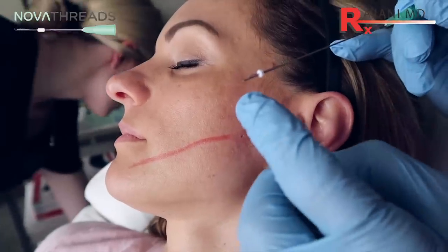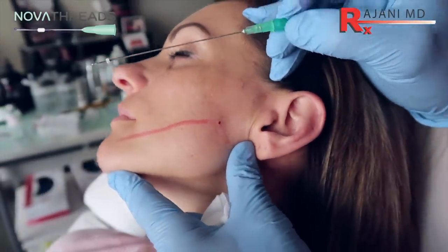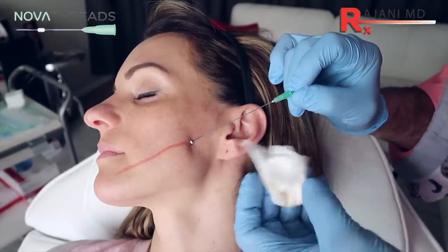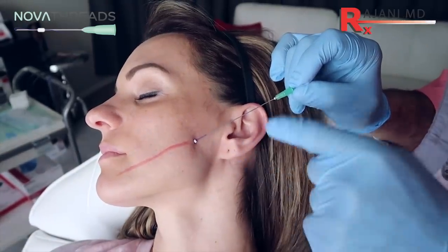New, totally blunt Barb 4. I'm going to have the patient look a little upward so I get a straight shot. I measure it up, come in with the bevel up. And then I'm going to take a clean four by four — we have the hair back and we've cleansed everything.